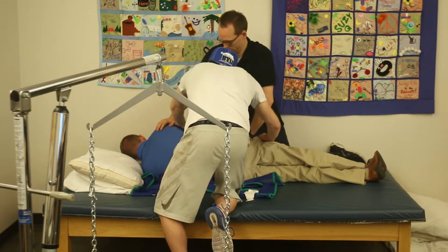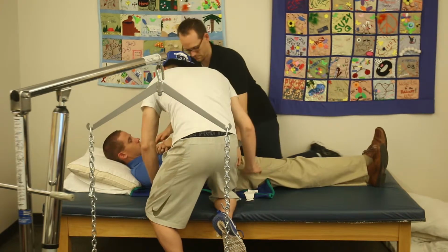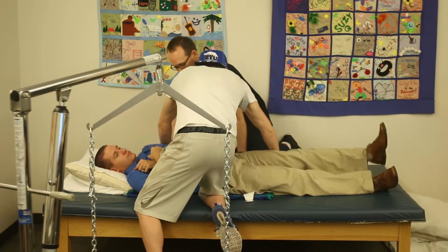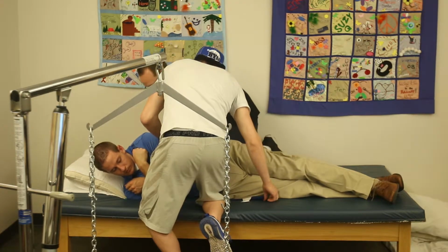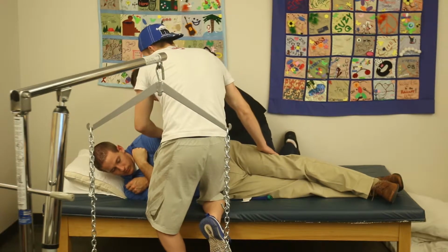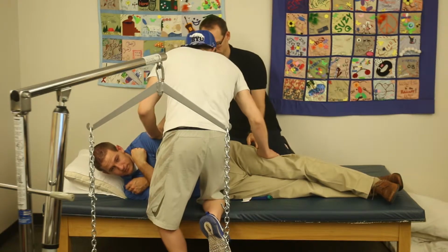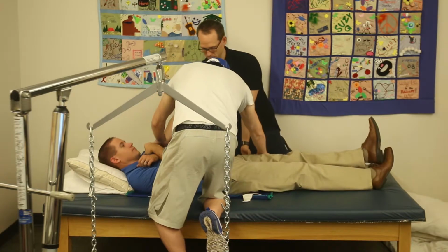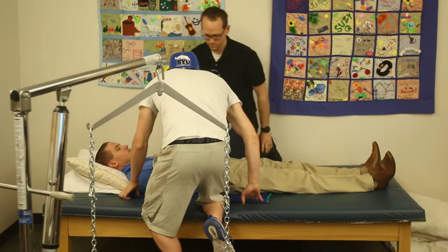All right, we'll roll you back towards me. 1, 2, 3. Okay, now this time you're going to come up towards me. 1, 2, 3. How are we doing? Hanging in there? Yeah, I'm doing great. Good. Okay, we'll roll you back down. 1, 2, 3. Okay, well, it looks like we're in pretty good position there.